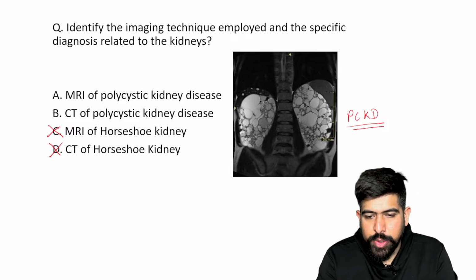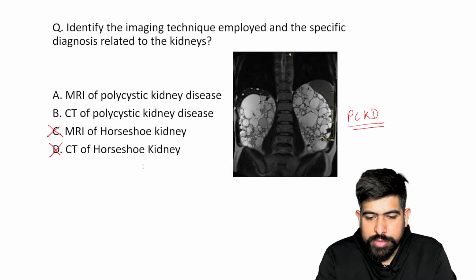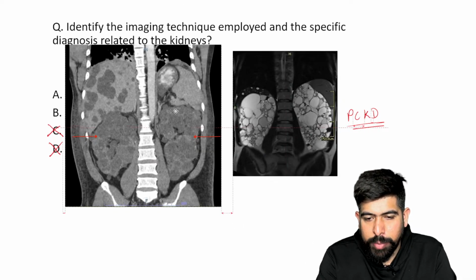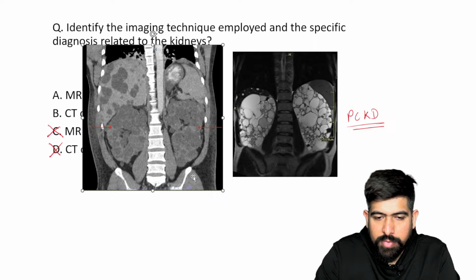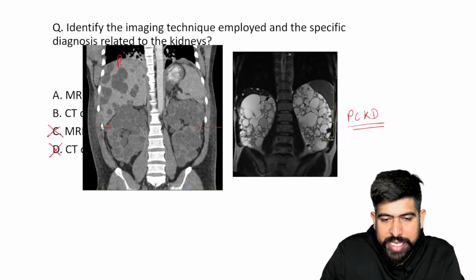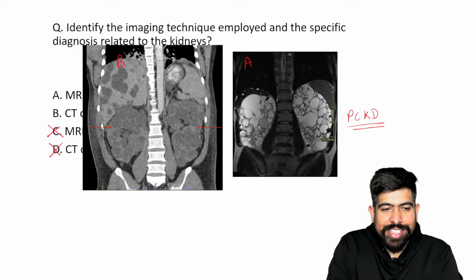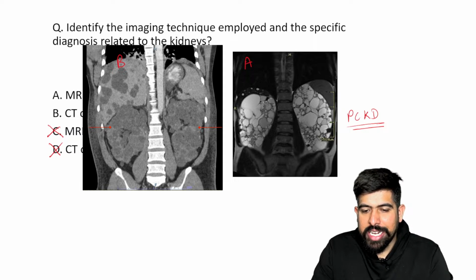Very good. As you are answering very well, I'm going to cover up both of the images and then cover up the things which are clearly seen to you. I'm putting both of the images and then I'm going to ask you about it. Now tell me, this is image A, and this is image B. Sorry, I made a mistake. This is image B, this is image A. Now tell me, which is the CT, which is the MRI? Now I think you can diagnose it clearly.